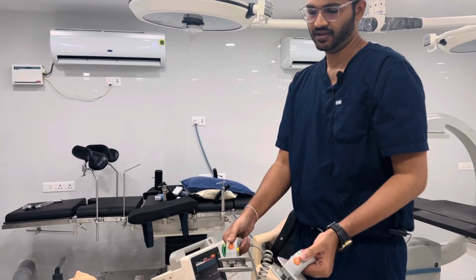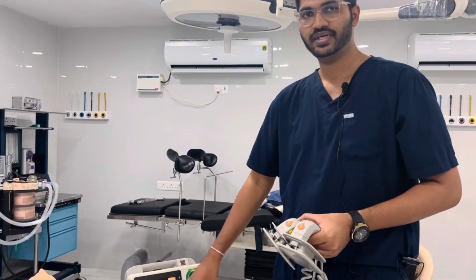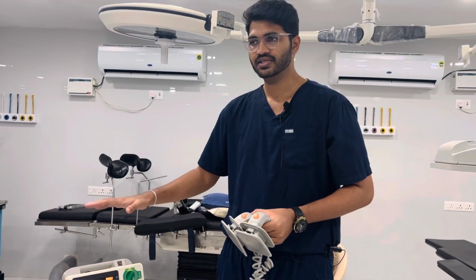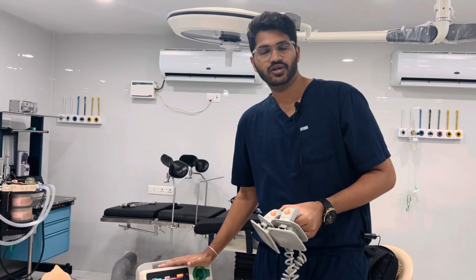This is the button for that. You have to press the shock, and the shock will be delivered. Once the shock has been delivered, the machine will automatically give you a rhythm strip showing whether the rhythm has changed or not. If you find the rhythm has not changed, then you can go to the next shock. So this is for defibrillation.